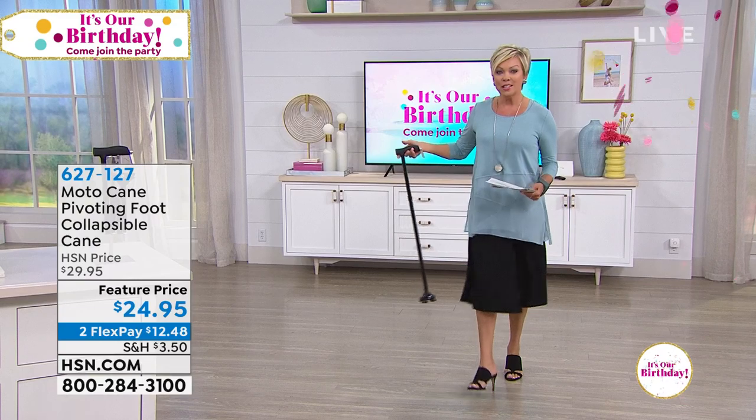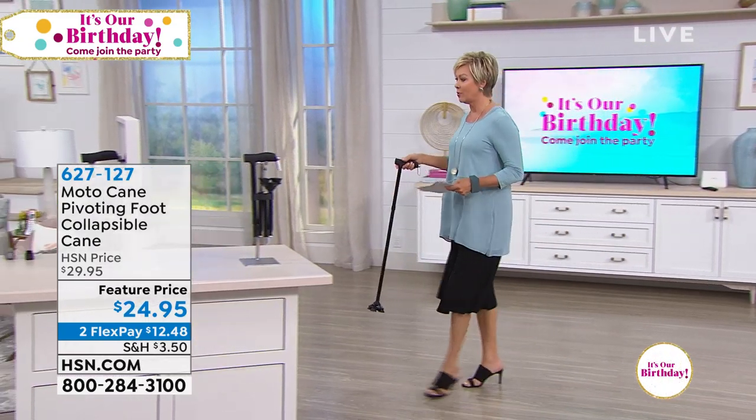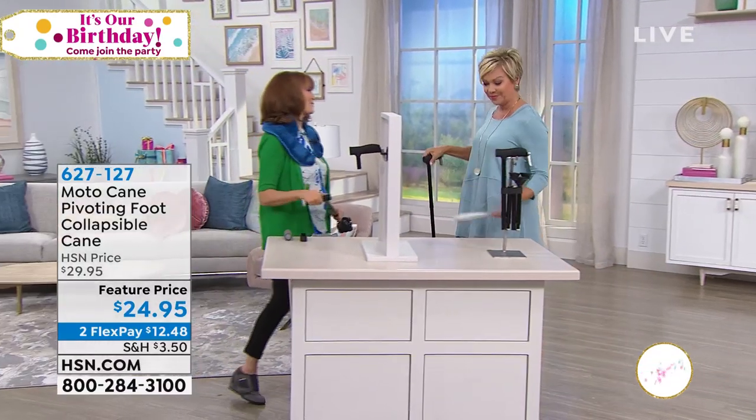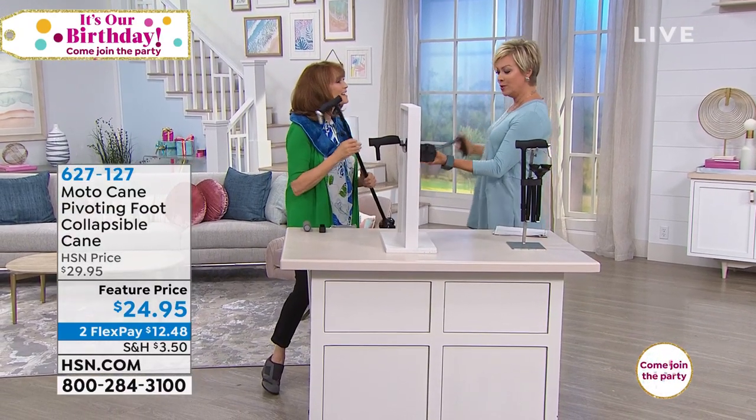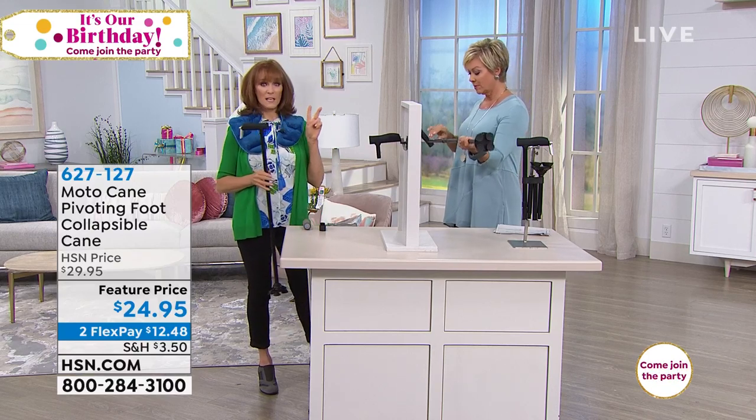Bonneville Sherman is here. We're going to talk a little bit more about this incredible cane — it's been a big bestseller for us. I like the stability. It's really unique, one of a kind, because it does two things in one.